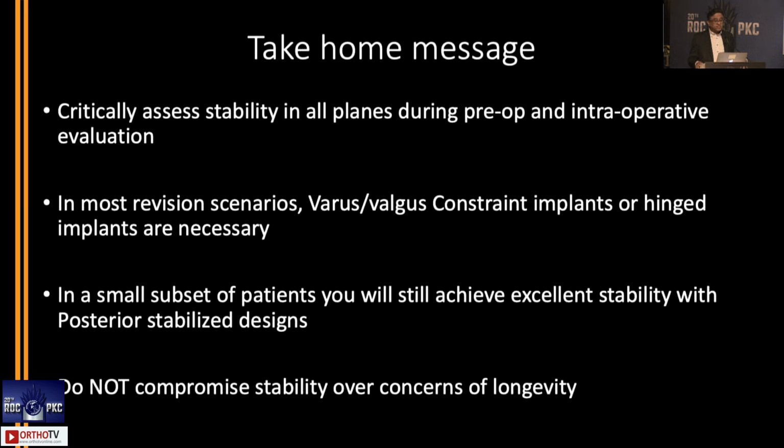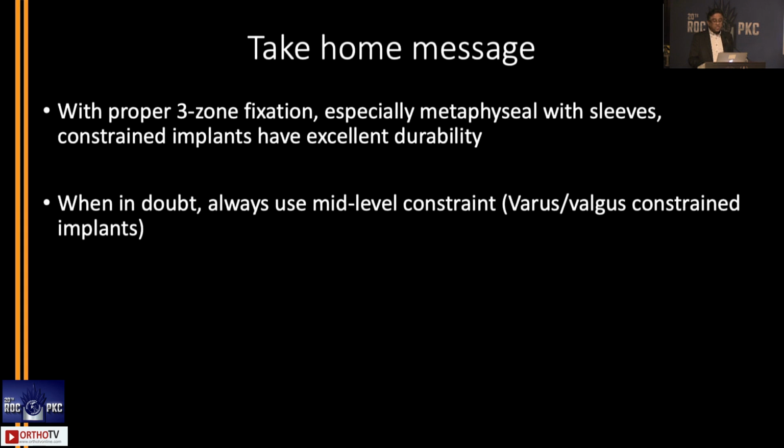So, take home message: critically assess stability in all planes, pre-op and intra-op. In most revision scenarios, VVC implants or hinge implants are necessary. In a small subset of patients, you will still achieve excellent stability with PS designs. Do not compromise stability over concerns of longevity. Important take-home message.